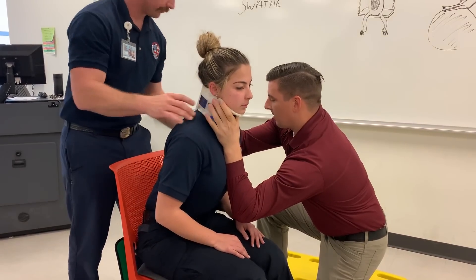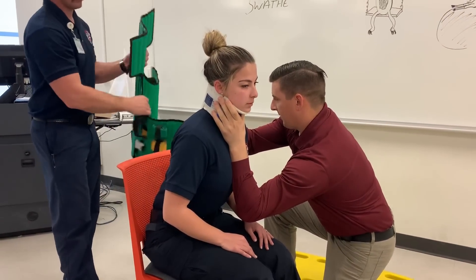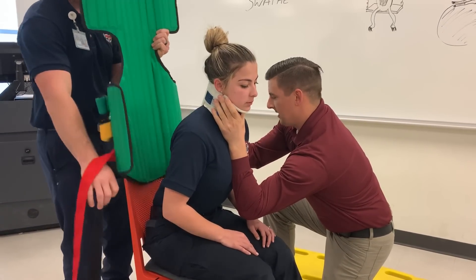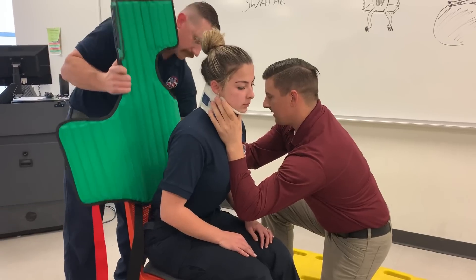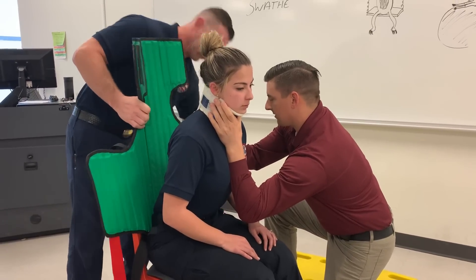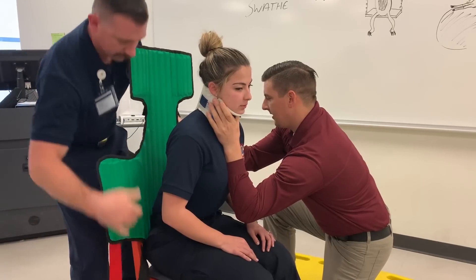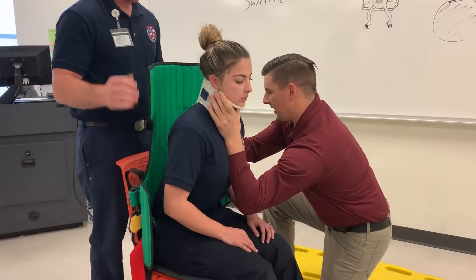My partner is going to grab the KED and place it behind the patient. While he's doing that, I'm observing the back for DCAP-BTLS, step-off, point tenderness, and spinal alignment. I'm also observing the back of the chest for any sucking chest wounds, paradoxical movement, flail segments, and any impaled objects.